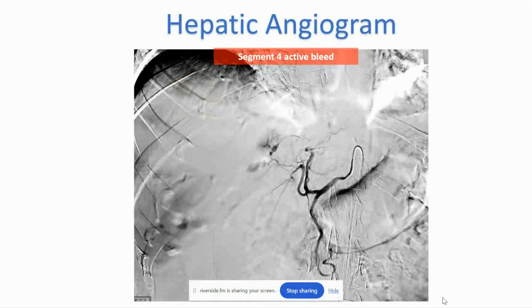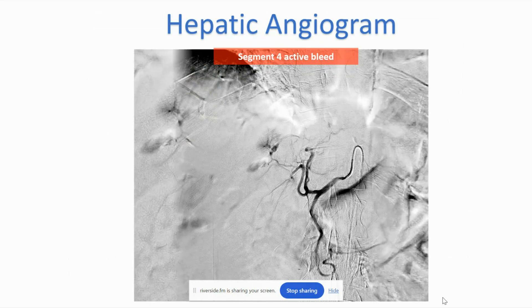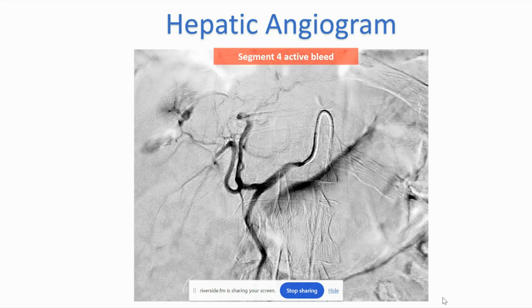Pretty large. So we took this patient to angiography. This is a selective hepatic angiogram. And again, as we sort of zoom up here, there is a Segment 4 arterial bleed that we had seen on the CTA.